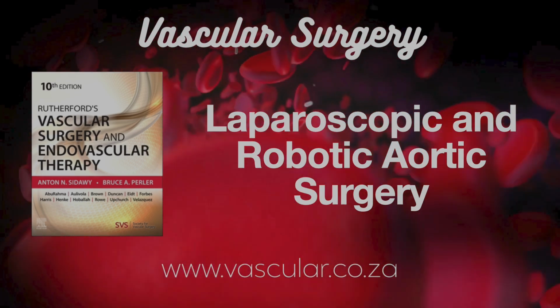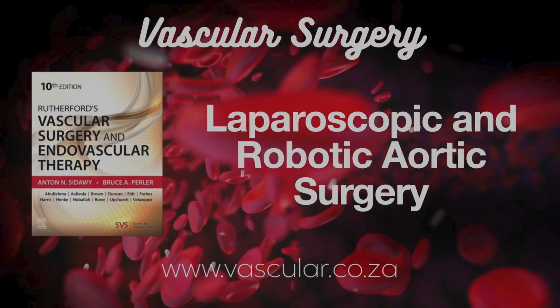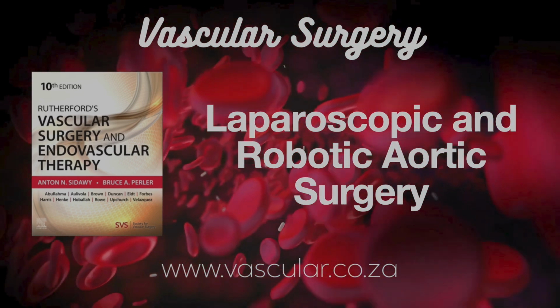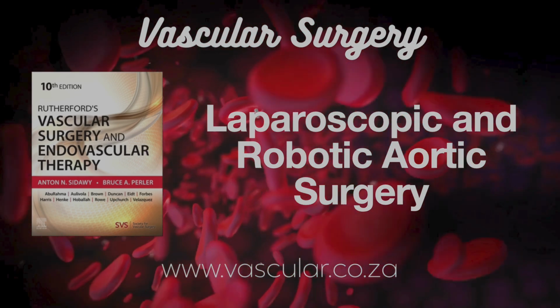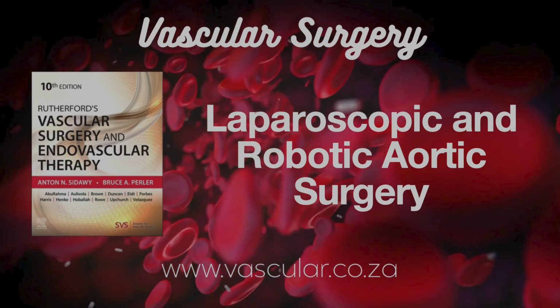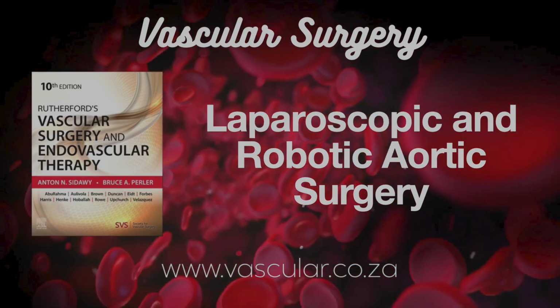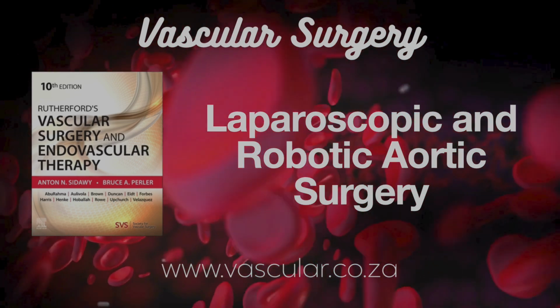Then the actual surgery involves going in from the left side, moving the left colon aside, getting to the aorta, which is in front of the kidneys in this approach. The key thing is going this route behind the colon, in front of the kidney. It gives you a pretty big working space. Oh, I see. Because the intestines sort of fall away. Exactly. Gravity helps, the tilt helps, it creates this natural opening. Okay, that makes sense. More room to work.